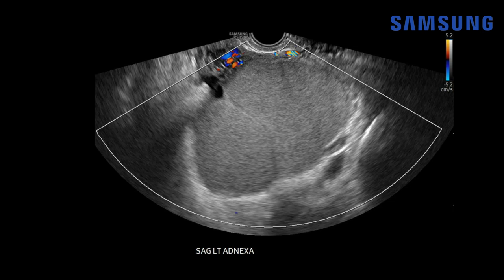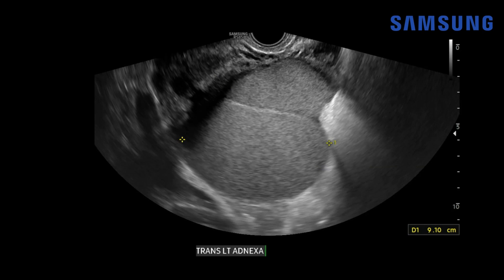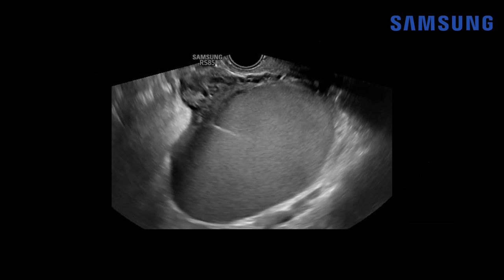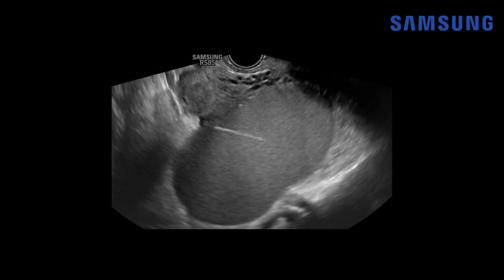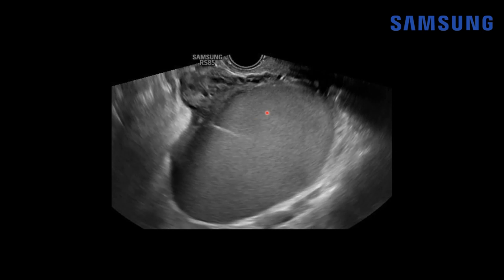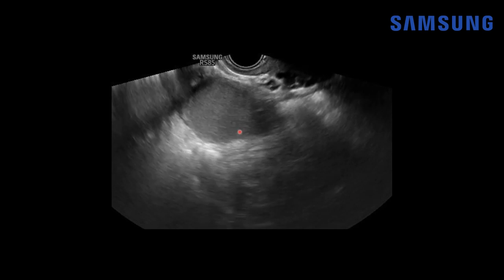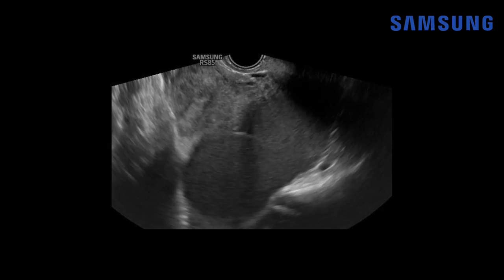We see no internal vascularity throughout the mass on color Doppler imaging and the mass is quite large, measuring up to 11 centimeters on the sagittal image and 9 centimeters on the transverse view. The septation is rather thin, traversing the lesion. Here's the sagittal cine clip of that ovarian mass — you get a great look at these homogeneous low-level echoes diffusely throughout. You can see why it's sometimes called a ground glass appearance, and we see that septation extending partially across the lesion.